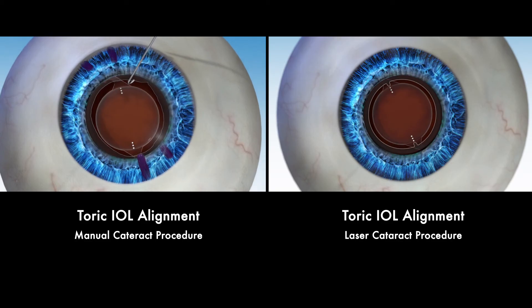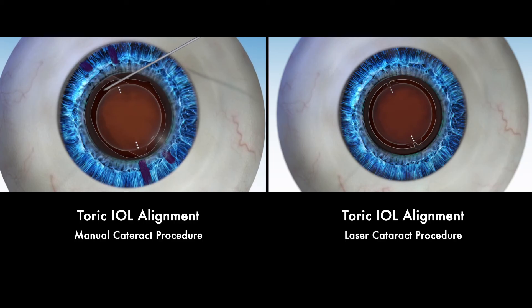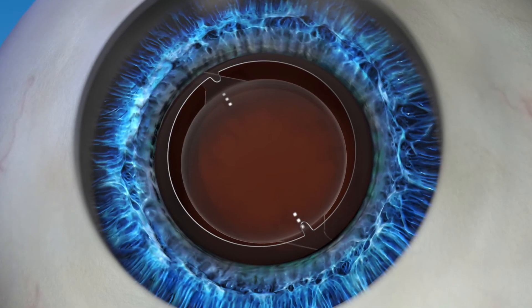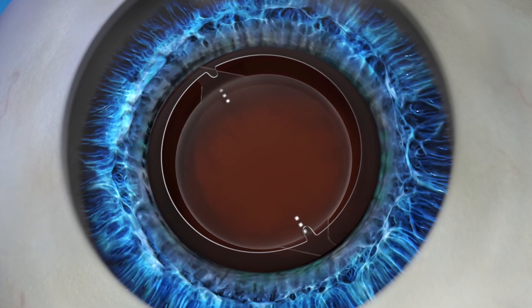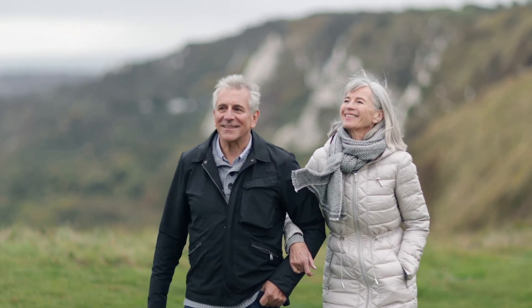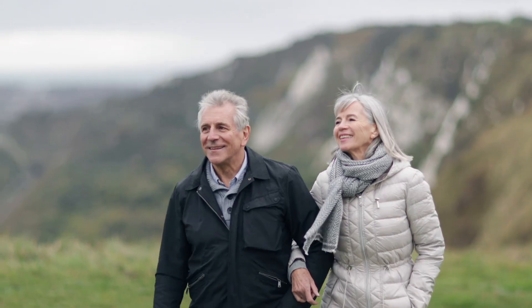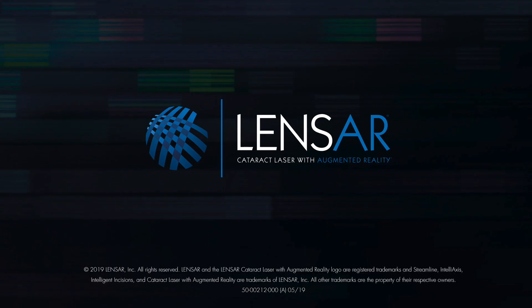Any inaccuracies can lead to misalignment of the toric IOL and may affect your vision after surgery. LensR helps eliminate any potential alignment inaccuracies, giving you the opportunity to restore your vision to its full potential. By choosing LensR laser cataract and astigmatism surgery, you are choosing the most advanced procedure possible, so you can rest assured knowing you have the latest technology available to treat one of your most valuable senses — your sight. Ask your eye surgeon about how you can choose the LensR laser system for your cataract and astigmatism procedure.